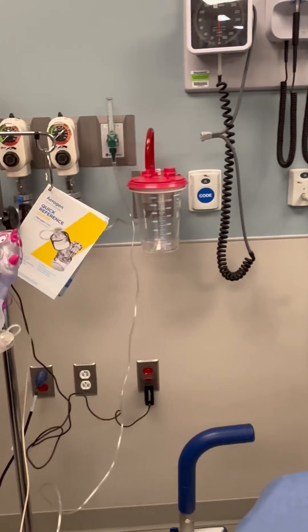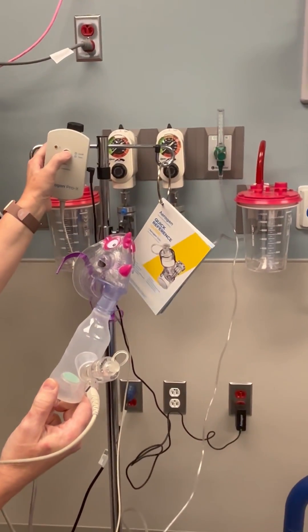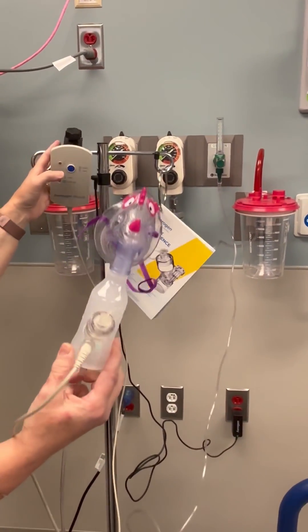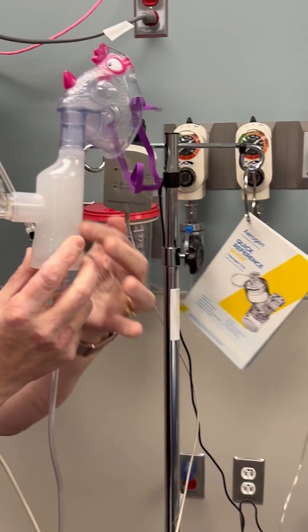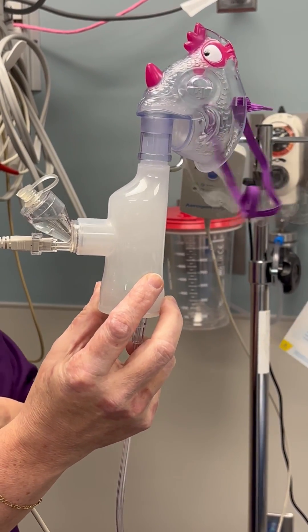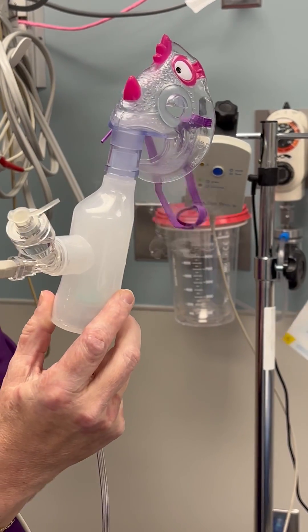When you come over to the Aerogen unit, you're just going to press that blue button. Everything's plugged in — turn it on. And now you can see how it's becoming — there's the mist. And now you just administer it to your patient.